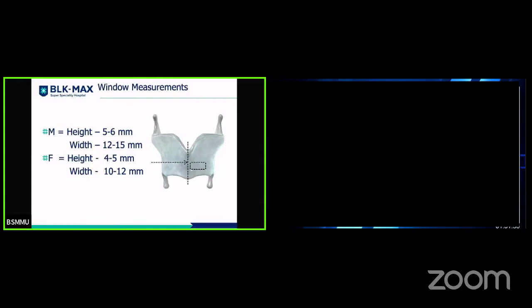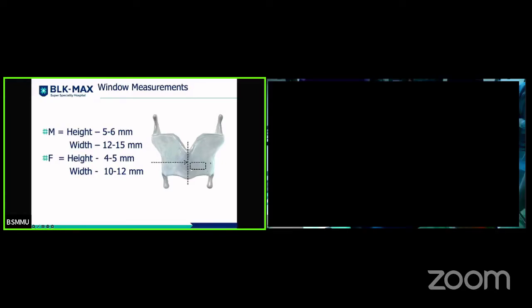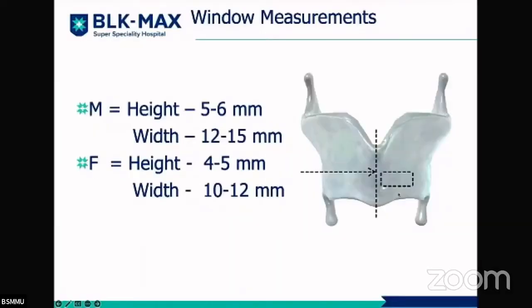And the important portion in this is this particular posterior-inferior quadrant, the angle. It should not violate the oblique line where the strap muscles are attached. This is the oblique line. Why? If it goes, what happens? It will push the arytenoid cartilage. So we don't want that.